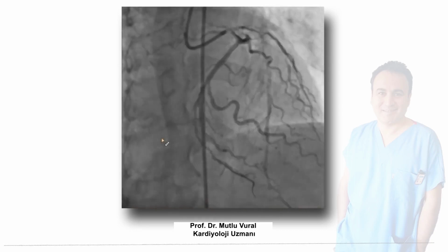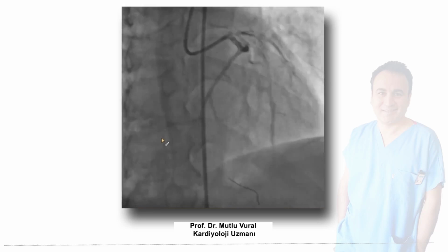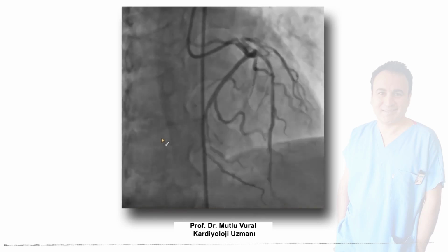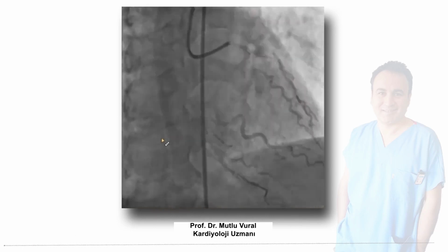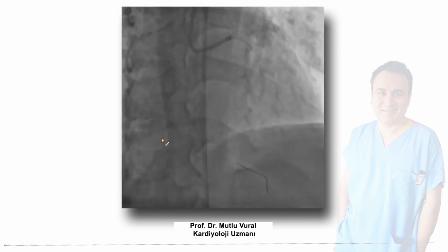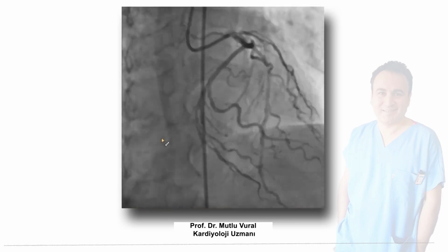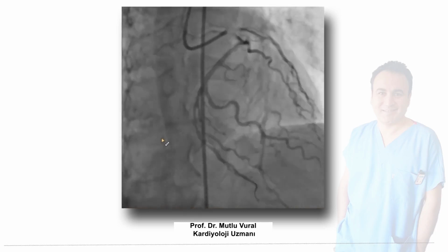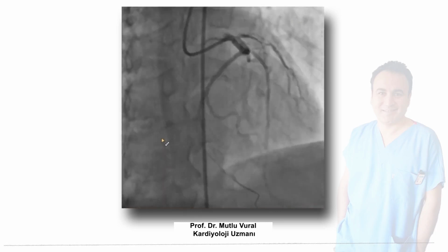It was not responsible for the symptoms and clinical findings. And then we checked the distal circumflex and finally found the guilty lesion and reperfused the culprit lesion.